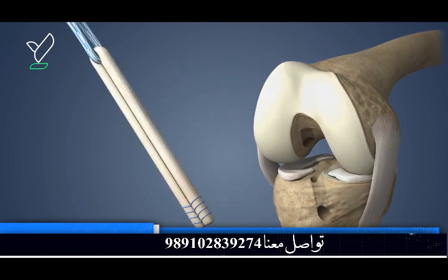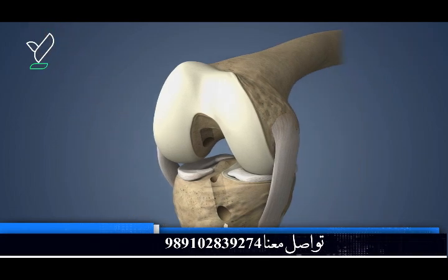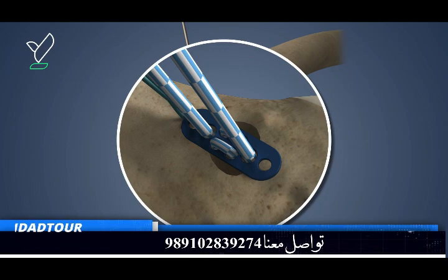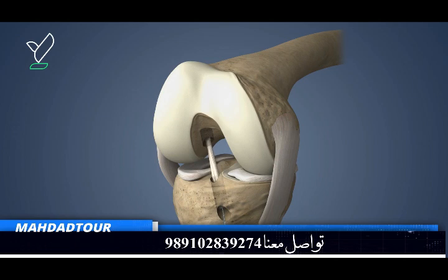After the hamstring graft is harvested and prepared, suture material is threaded through a special guide wire, which is then used to pull the graft up through the tibial and femoral tunnels. The metal plate lies flat on the bone surface, anchoring the femoral end of the graft in place. While the plate is the most common fixation method for the femoral end, some surgeons may use traditional screws. The surgeon may twist the graft before tibial fixation to mimic the rotational fibers of the native ACL. Over time, the tunnels will fill in with new bone, incorporating the graft tissue.